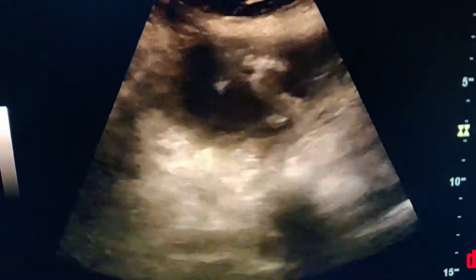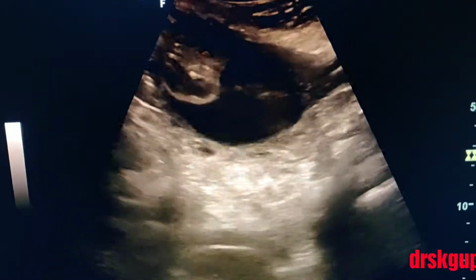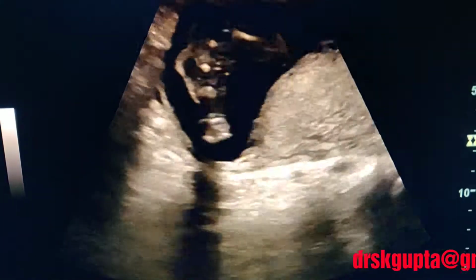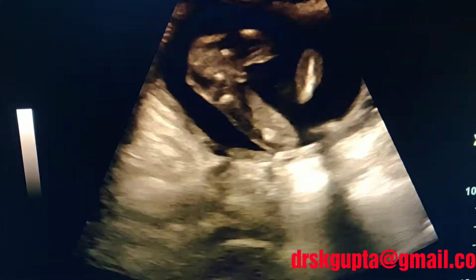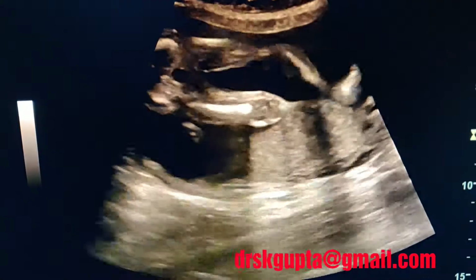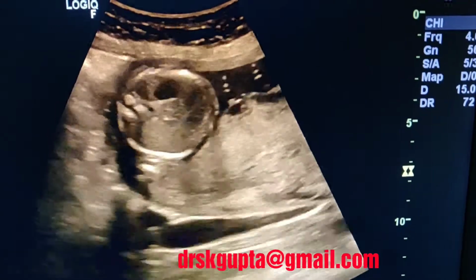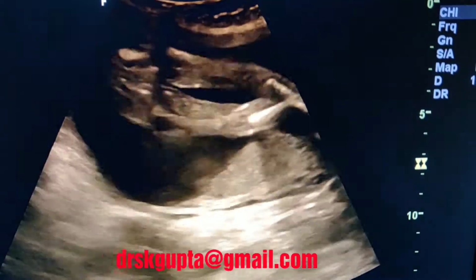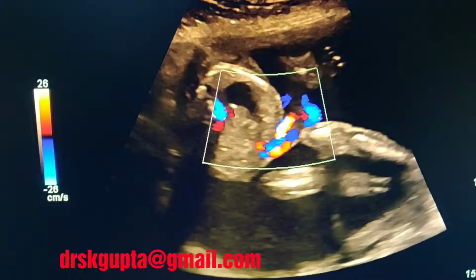Once you have scanned the feet completely, only then you move on to the other limbs, that is the upper limbs. You see both the feet are so beautifully seen, and the baby is having foot presentation. This is the section of the heart, and this is the stomach bubble being seen. Both the feet again, and you can see the cord also being attached. This is the attachment of the cord at the baby's abdomen.